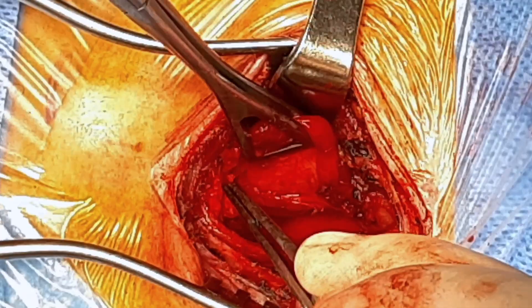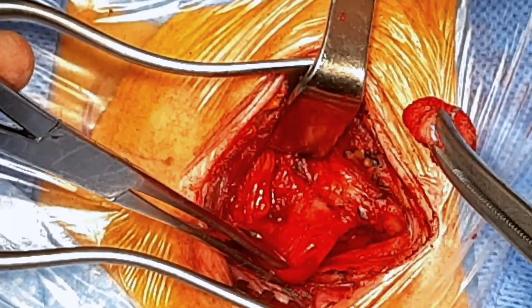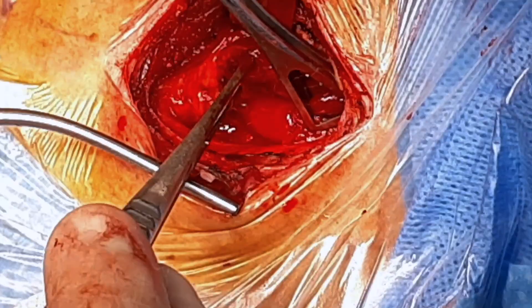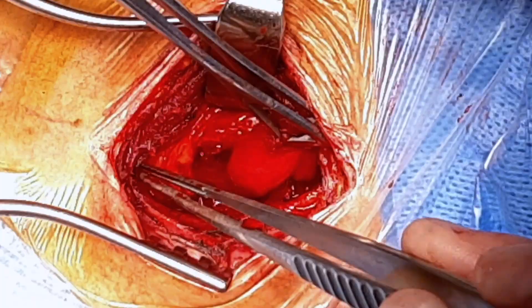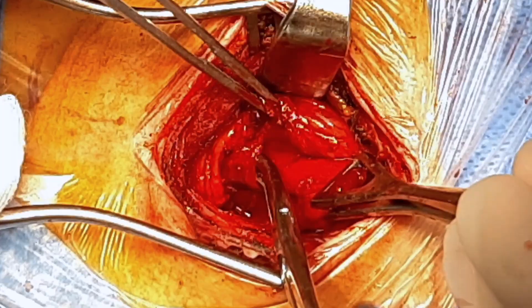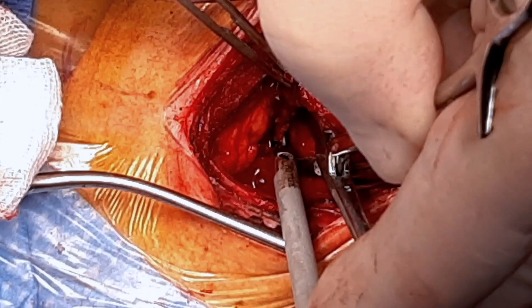This is the dissection of adhesions surrounding the Zenker diverticulum, which is needed to reach the neck of the diverticulum. We are now almost ready to pass a stapler on the base of the diverticulum. We then extend the myotomy inferiorly onto the musculature of the esophagus itself, which should further reduce the risk of recurrence.